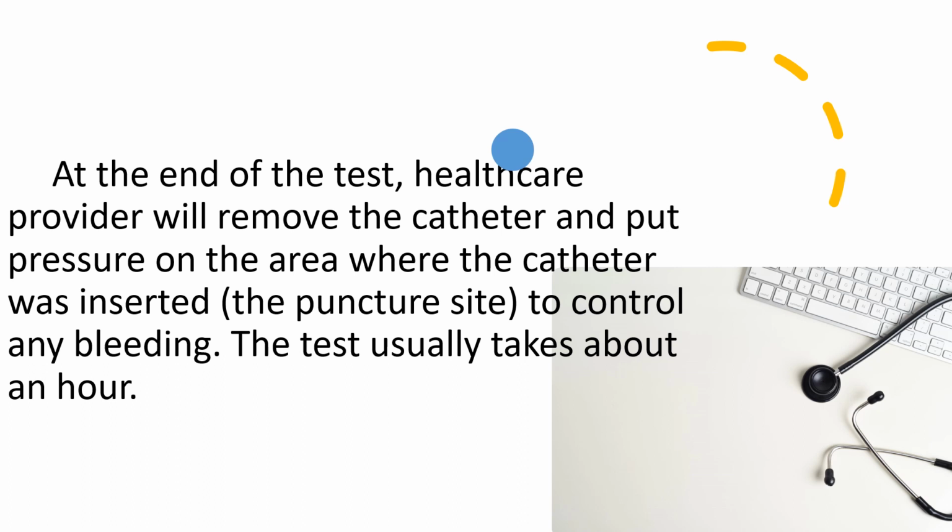So at the end of the test, the doctor will be removing the catheter and they will be giving pressure for some time at the puncture site to control bleeding. The test usually will be taking an hour.